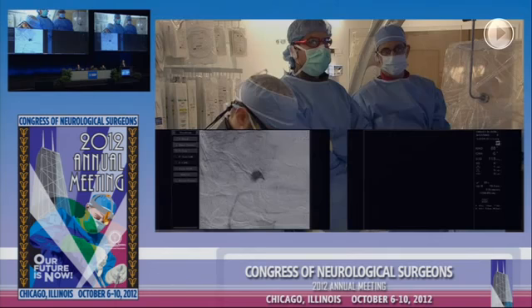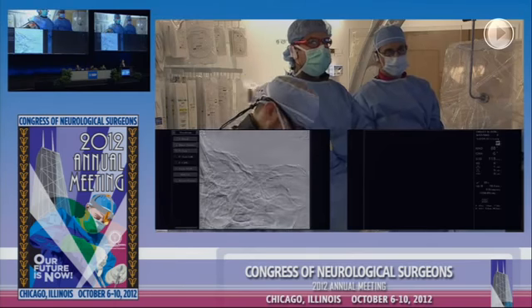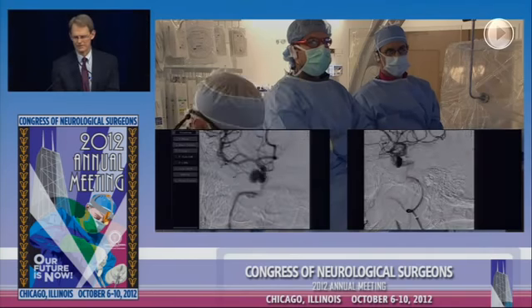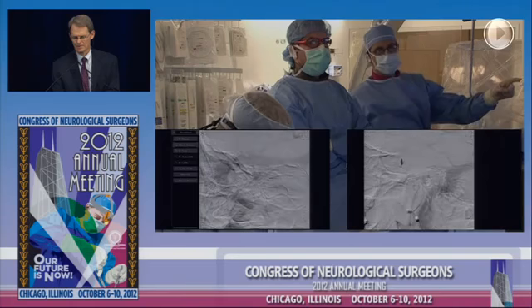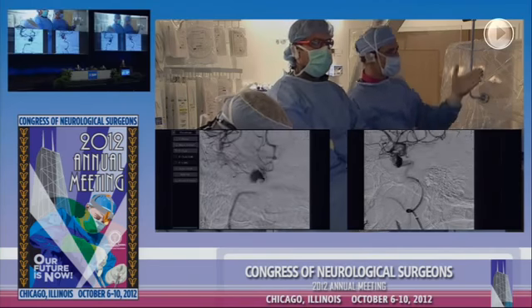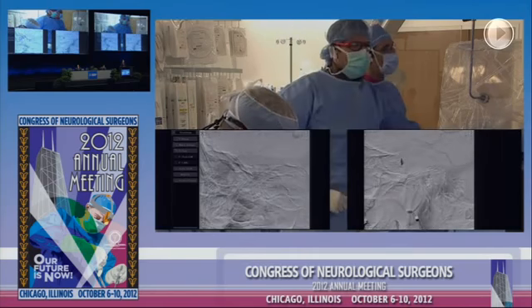The lateral view. Okay. The nice thing about this technology is that when you saw it, we started pretty much from scratch. It probably took 10, 15 minutes to get the delivery catheter up there. You can see the dye hanging out still in the aneurysm. So, Nick, we can place another one if you like. I can see clearly that there's stasis and thrombosis already happening.